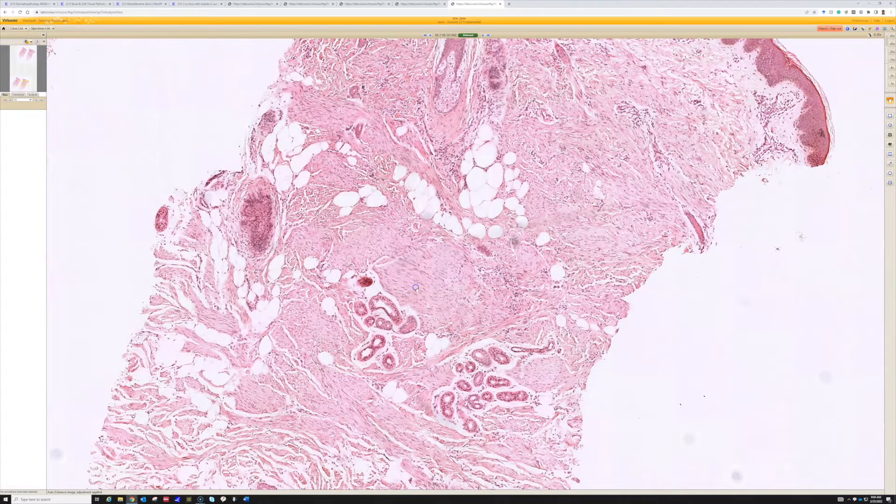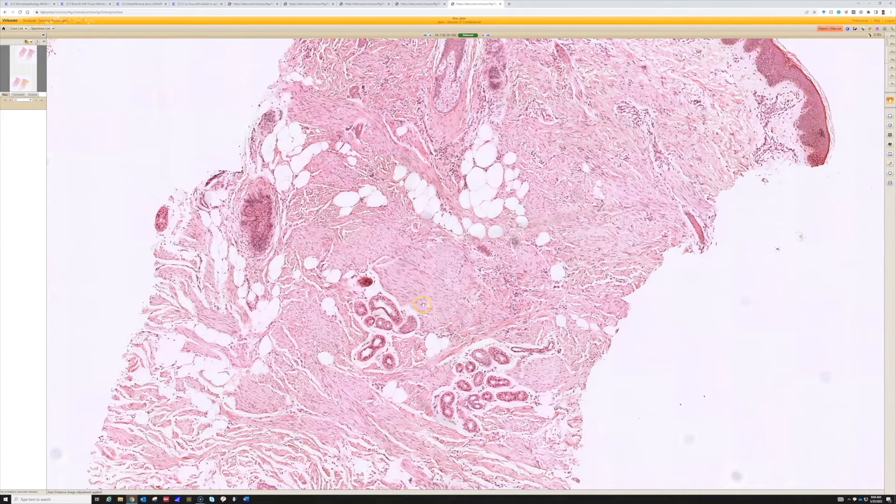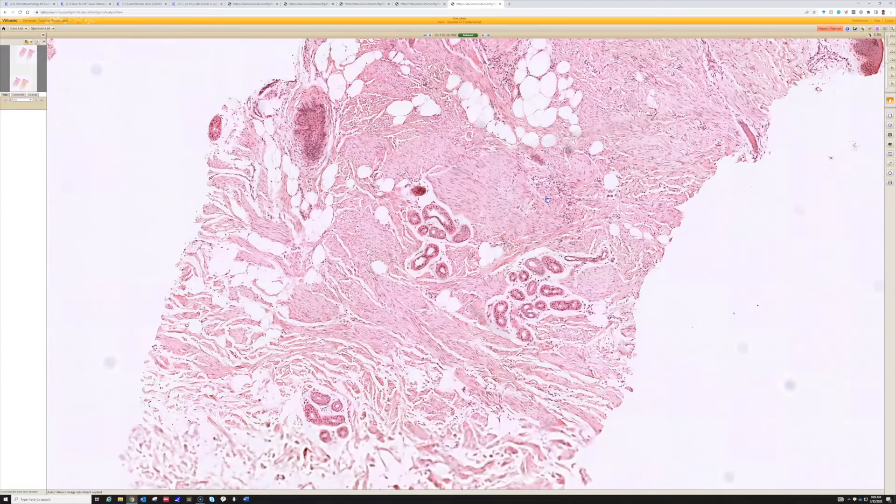They're actually fibroblasts or myofibroblasts, but you don't need to do a stain on these, in my opinion, for muscle markers, because actin is only going to be positive about half of the time. So even if it's actin negative, if it looks like this, I would still say it's still a dermatomyofibroma.